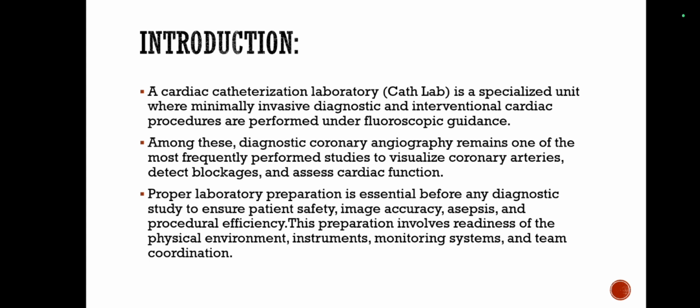Proper laboratory preparation is essential before any diagnostic study to ensure patient safety, image accuracy, asepsis, and procedural efficiency. This preparation involves readiness of the physical environment, instruments, monitoring systems, and team coordination. So, in this presentation, we are going to see how we are going to prepare the cath lab before any procedure.